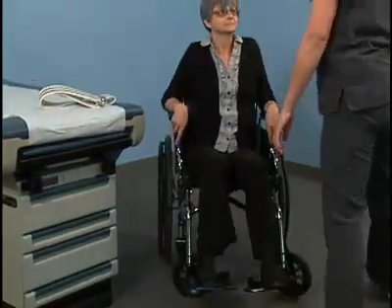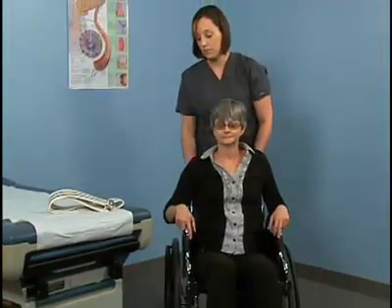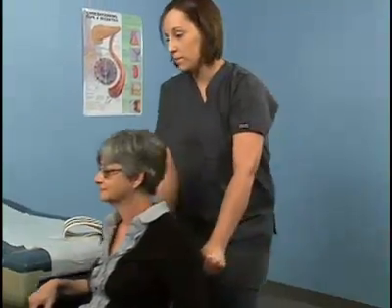Wheelchair transfer is not usually charted. However, please note any significant findings such as weakness or unsteadiness.